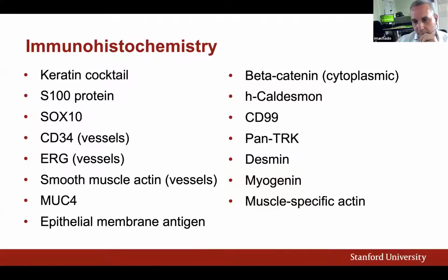And I'm seeing Sylvia mentioned myofibroblastic sarcoma, certainly low-grade myofibroblastic sarcoma, on the differential. I think that's a great point. You'd like to see some smooth muscle actin expression in a myofibroblastic sarcoma, but of course, I would not exclude that at this point. Obviously, with the fairly low-grade features, we would also consider myofibroma. It may be difficult in this context to distinguish those two, especially in a congenital tumor like this. Okay, so I'll move on.